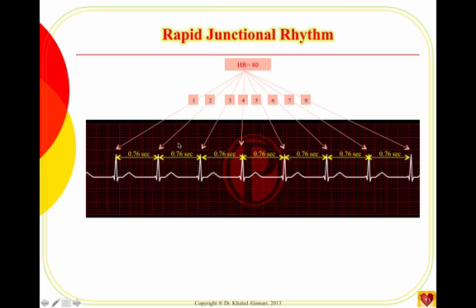One, it's two types, and that's the heart block. Now, these are important because they're common. Okay, the first degree heart block.